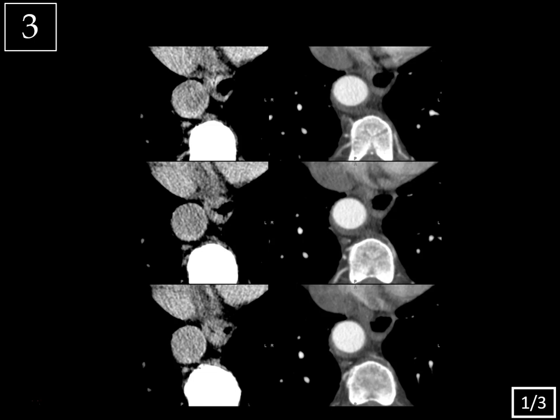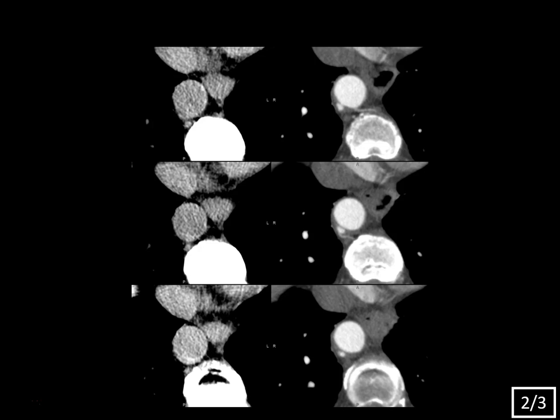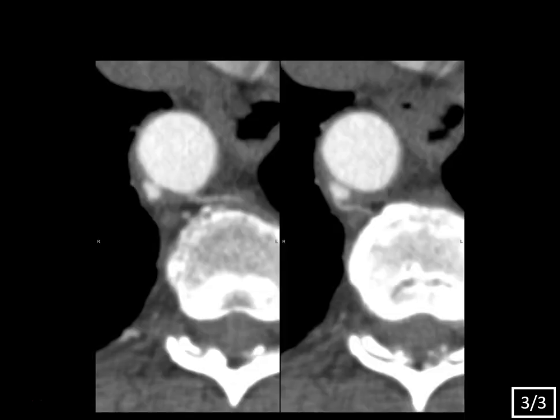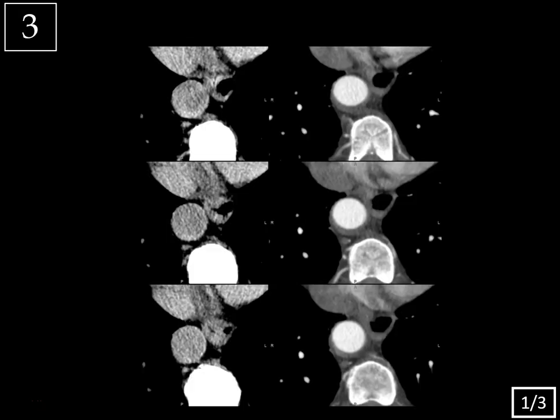Case 3, non-contrast and angiographic images of the descending thoracic aorta. Here we're looking at another intramural hematoma. On the contrast-enhanced images, you can see that it looks like a rind of hypodensity that you could confuse with plaque, but it's very smooth. And on the non-contrast images it's hyperdense, indicating intramural hemorrhage. This would be a type B hematoma since it's only involving the descending thoracic aorta.